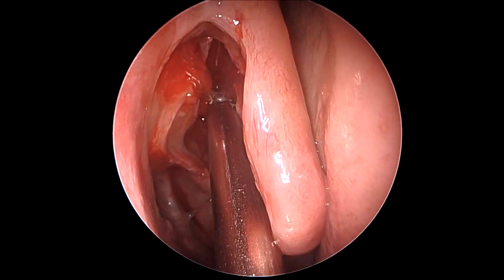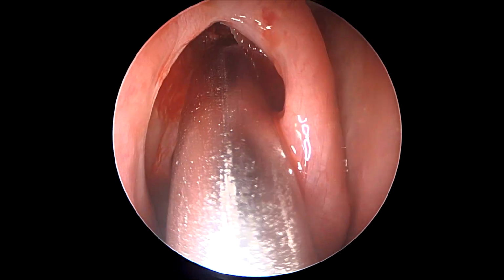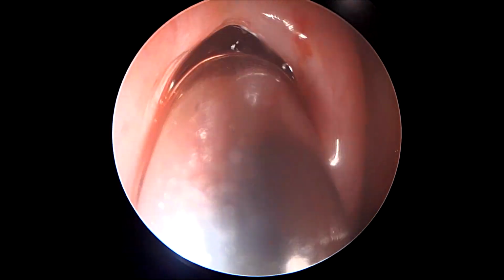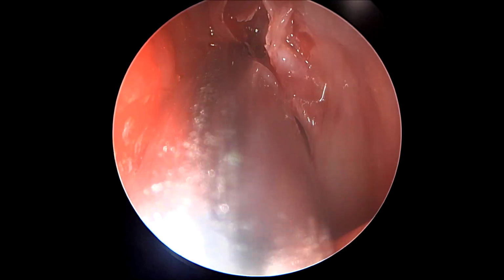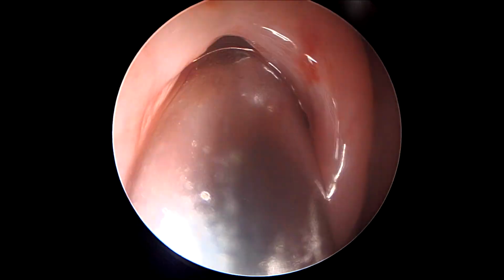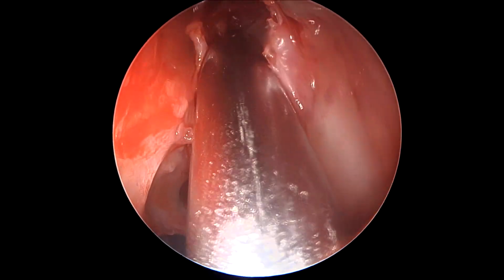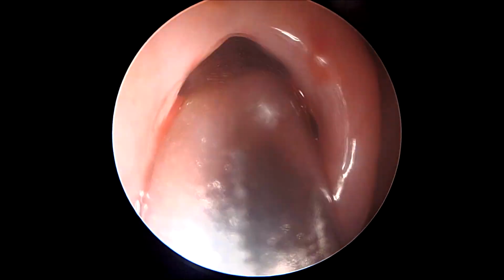Initially we do not use the shaver in the starting part because we want to fracture the thin bone, and we resort to the shaver blade only once we feel that we have fractured a lot of thin septations, which can then be taken down by a shaver blade. Using a shaver blade on hard, thick, unfractured bone often would lead to just bleeding and add to the surgical frustration in this very narrow region.